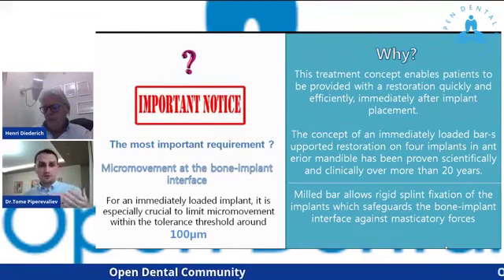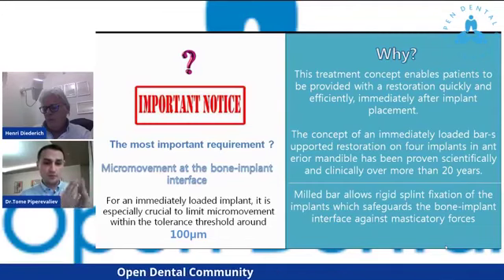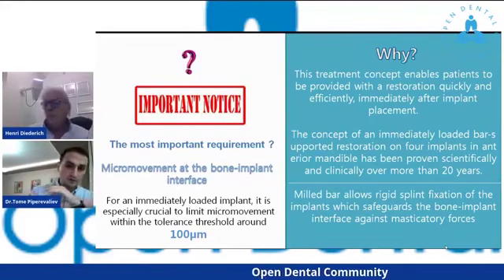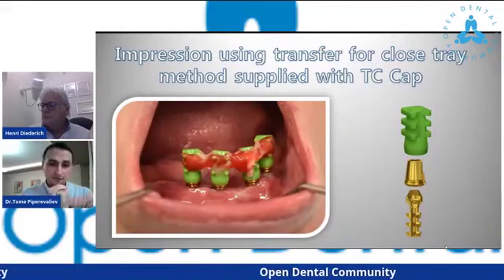For immediate loading, if we want success, we must limit the micro movement at the bone implant interface within a tolerance of around 100 micrometers. After 1 week of inserting the tissue-level compressive MS implants, we are taking the final impression.